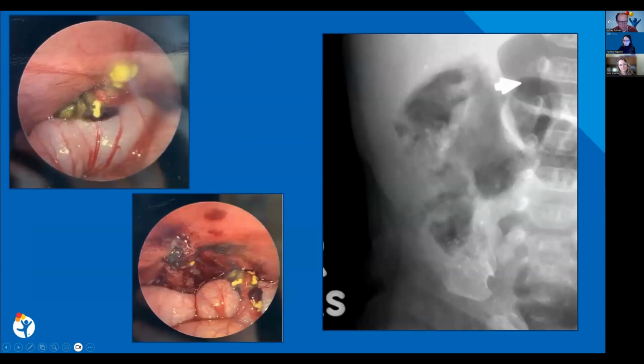I have a couple intraoperative images here, so we can see all of these yellowish, nodular looking things here. This is in the right lateral abdomen up near the colon, and then this is down in that inguinal region. So you can see all of these little calcified yellow structures. The patient had a radiograph, so we can see some calcifications along that right lateral abdomen and down in the inguinal region.